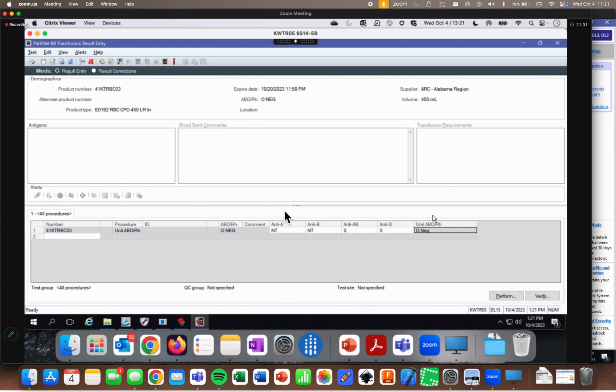The system generated my answer. In contrast, the system-validated one, I would fill in my component procedures, and then I'd come over here and I'd have to manually select that interpretation. And the system is going to double check and make sure that I answered it correctly. So it's kind of like the difference between just using a calculator on a math test versus doing it by hand and then someone checks your answers, right? So this one is the calculator version. The system validated is where you do the math and then you check it to see if it worked.